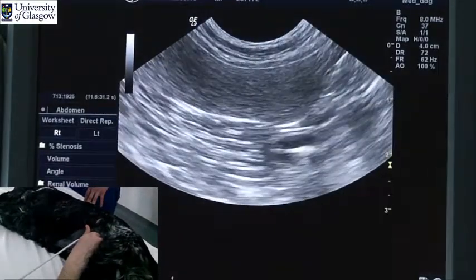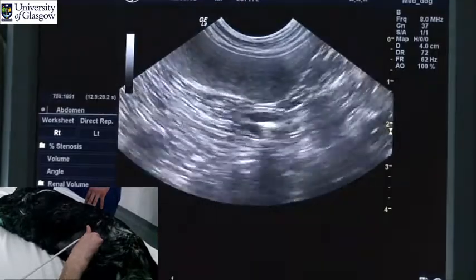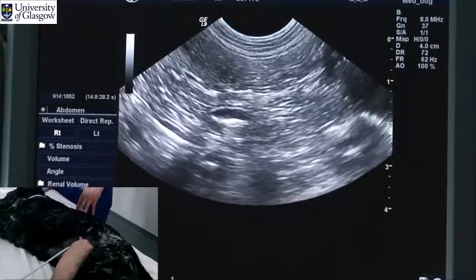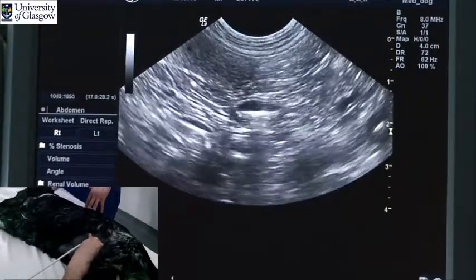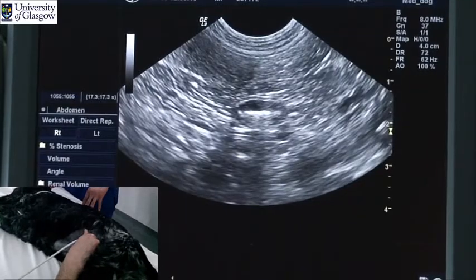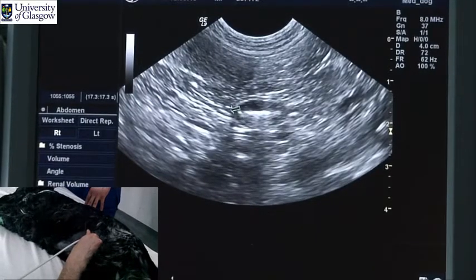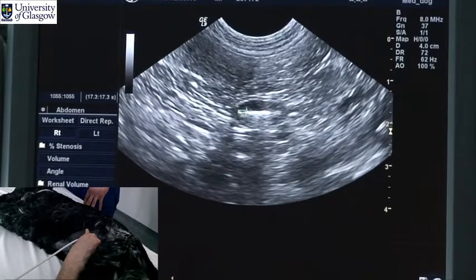On this image here, in the centre of the screen, we have a loop of small intestine, probably jejunum, seen in short axis or cross section.